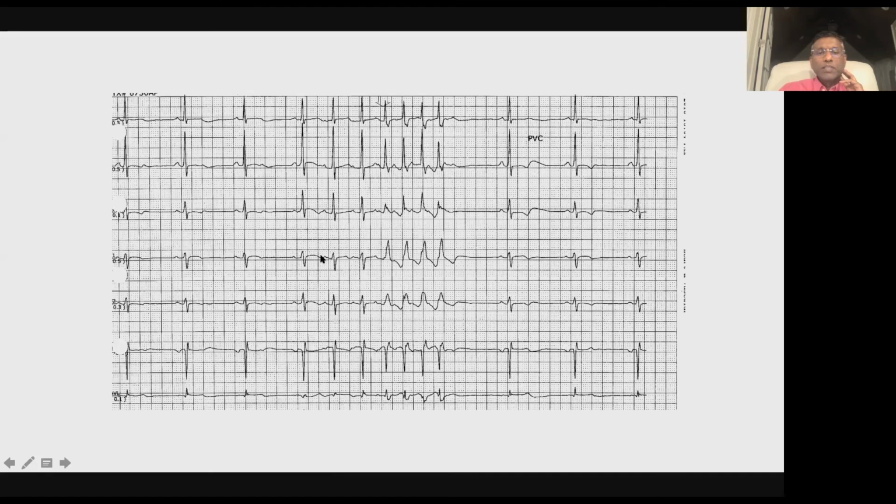P, P, P. And this was the sinus rhythm P to P interval. So you see atrial tachycardia has started already here. Do you see that? Yes, sir. And then it's warming up. Atrial tach gets faster and faster, and then it starts conducting with bundle branch block. So this is a SVT with bundle branch block.